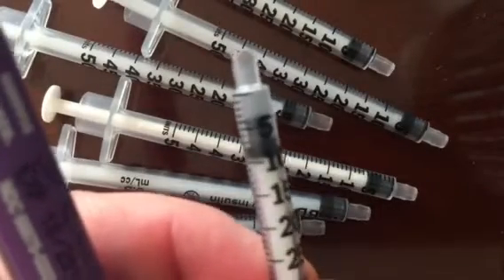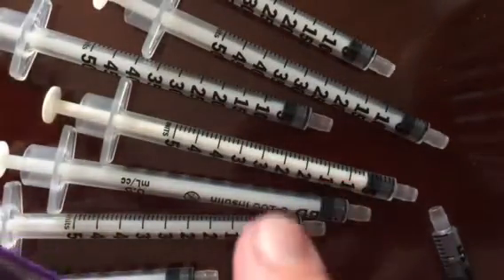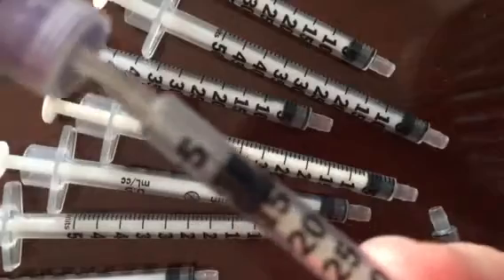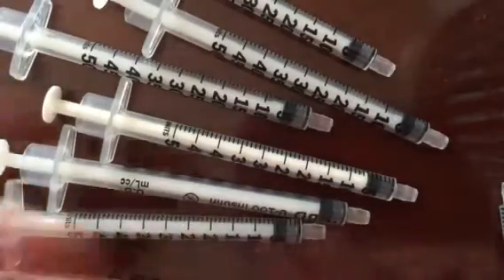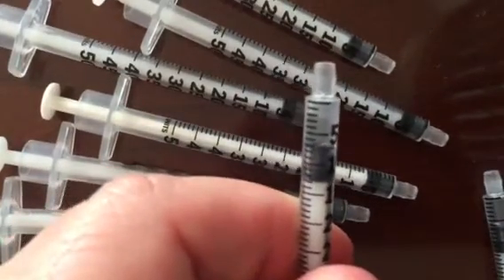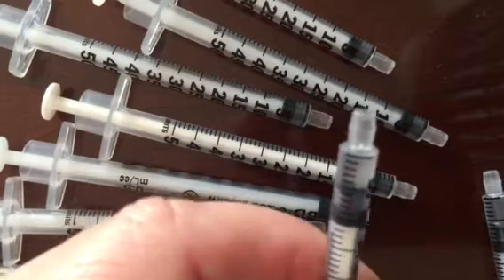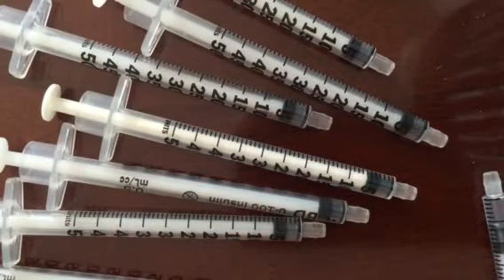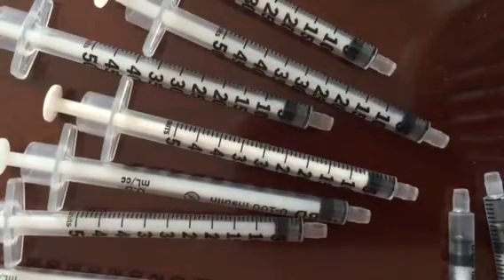So let me do a second dose. Pull back just a little more. I'm going to activate. And all right. And again, push the air up so that I'm at the 1 mark. All right, this one I got 6.